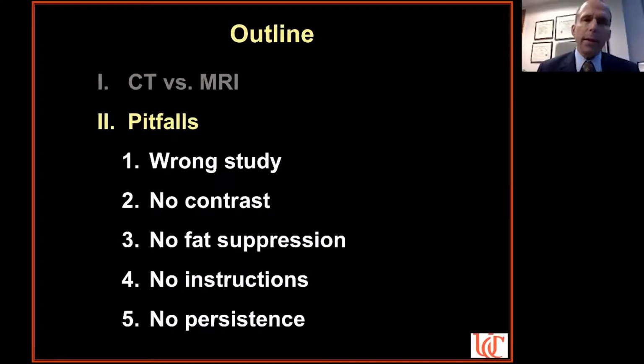I want to move on to sort of the second part of the webinar, which is pitfalls. And here are the pitfalls I'm going to consider. Wrong study, no contrast given, no fat suppression, no instructions, and no persistence. And I'll run through each of these briefly.